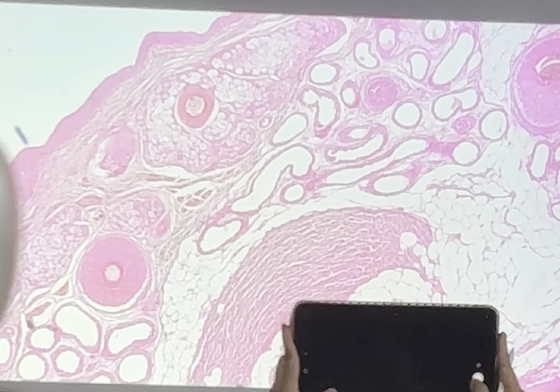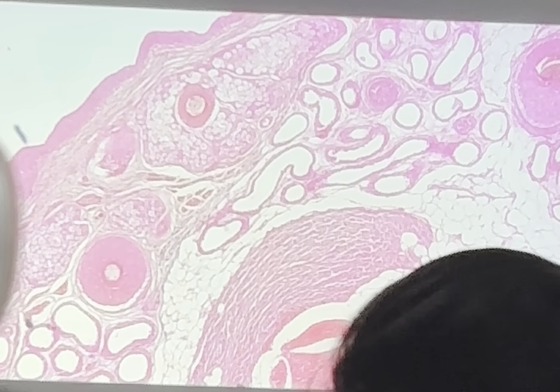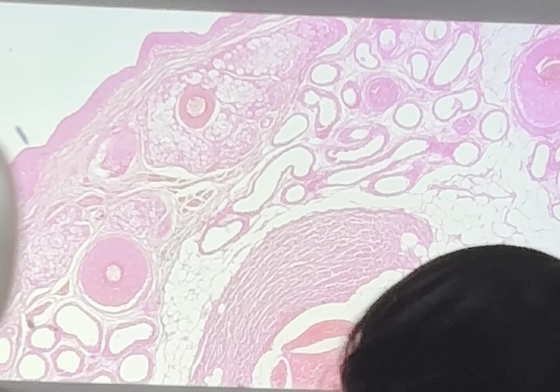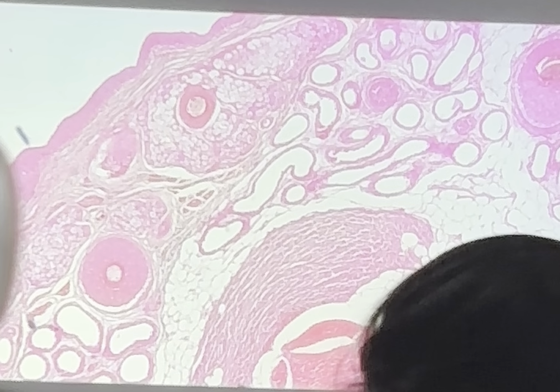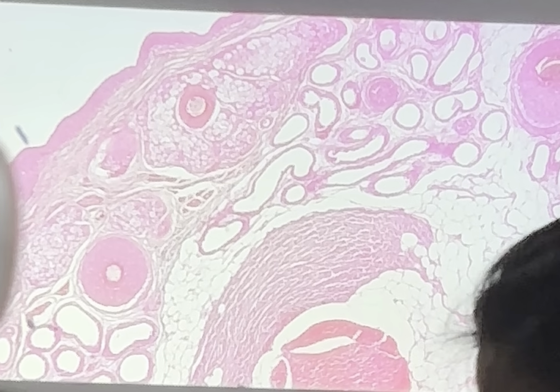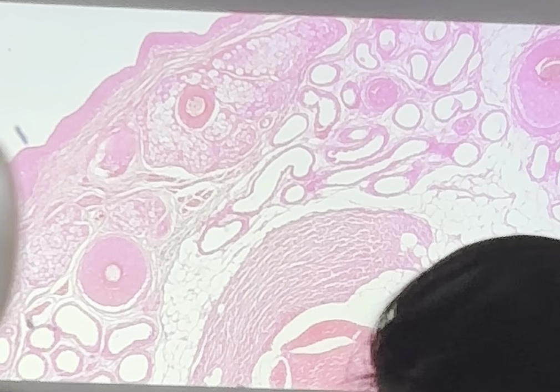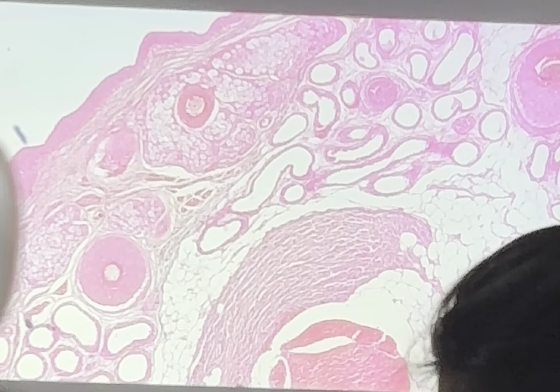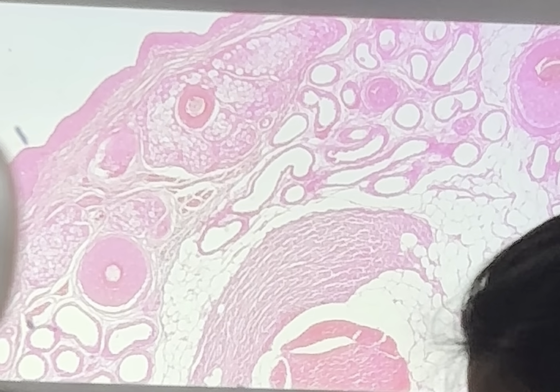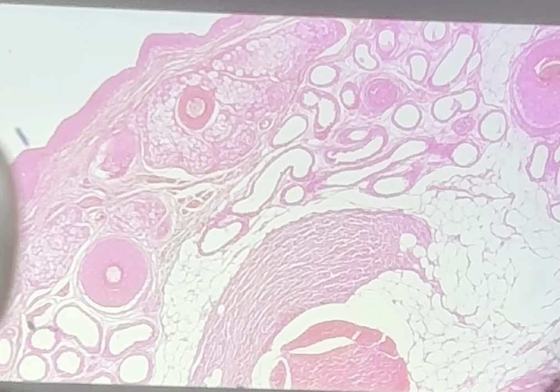What's your diagnosis? Teratoma, or mature cystic teratoma, or dermoid cyst. Okay? This is a very common neoplasia that you see in usually reproductive age women. Is this benign? Does it really look anaplastic and pleomorphic? It looks like normal skin adnexal structures. So this is a benign tumor. However, in the male, is this benign? No, it's actually malignant in men. In males, this is malignant. In females, it's actually benign.